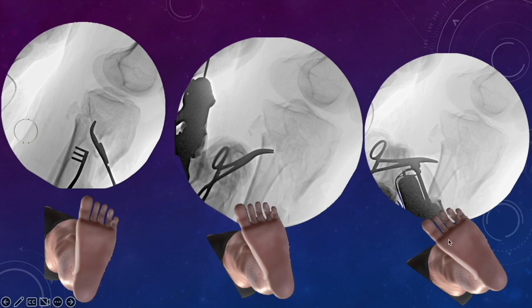If you rotate the tibia more internally, you will be able to get the better view of medial condyle, and there is adductor tubercle that can be visualized here. So this is the medial condyle, while this part is the lateral condyle. But we are still not sure whether the depression has been adequately restored or not, because the only thing we are seeing here is the anterior half of the lateral condyle. The posterior part of the lateral condyle, which is adjacent to the fibula somewhere here, is still hidden behind the tibial spine. So there is another trick to visualize this part also.